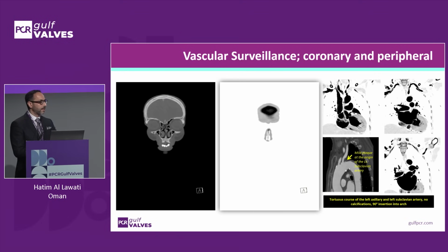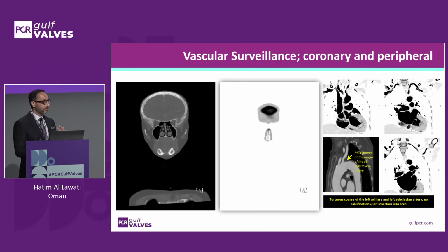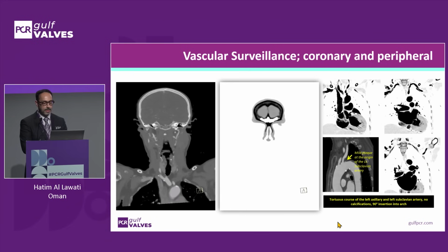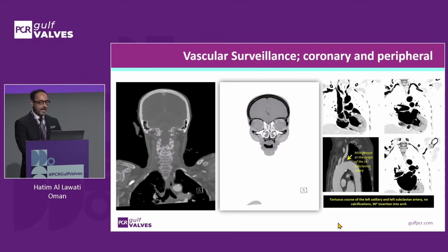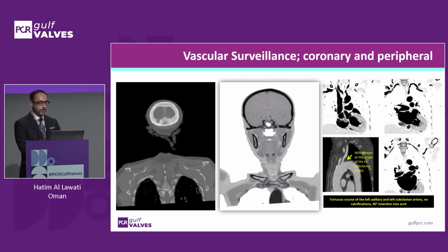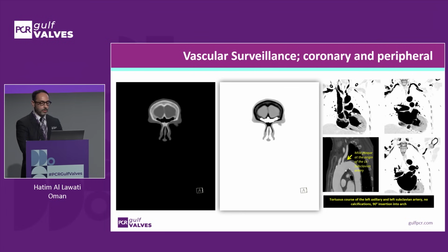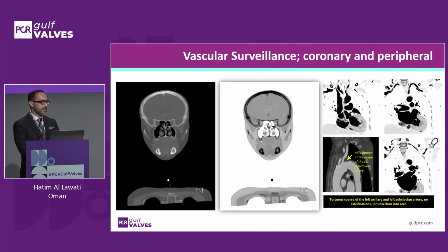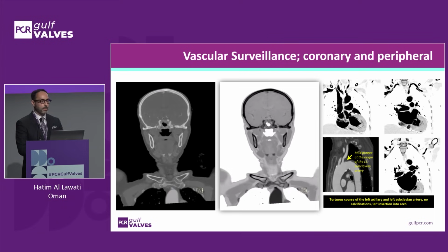Further vascular surveillance revealed surprisingly disease-free vessels in the upper extremities. If you look at the running clip here, her left axillary and left subclavian arteries were relatively disease-free, albeit quite tortuous in their course, as you see in the running clip. And there was some plaque in the proximal segment, and hence we decided that we should probably use this approach for the implantation.